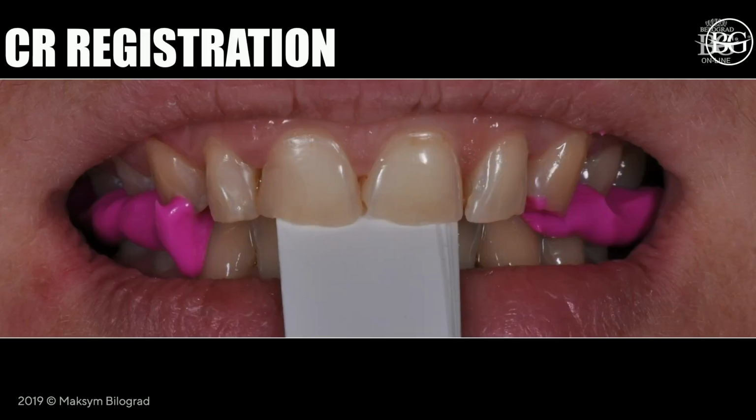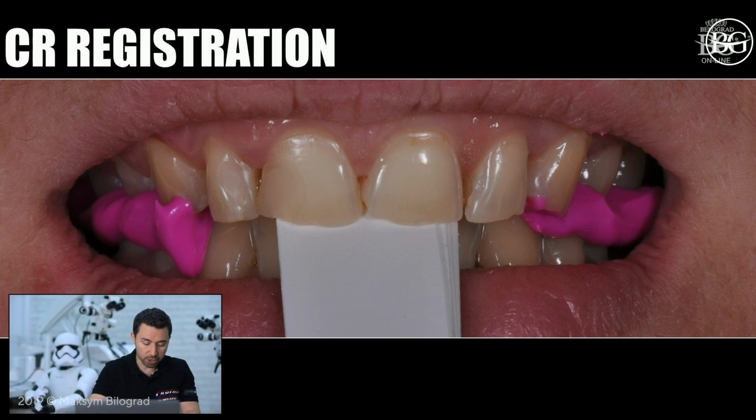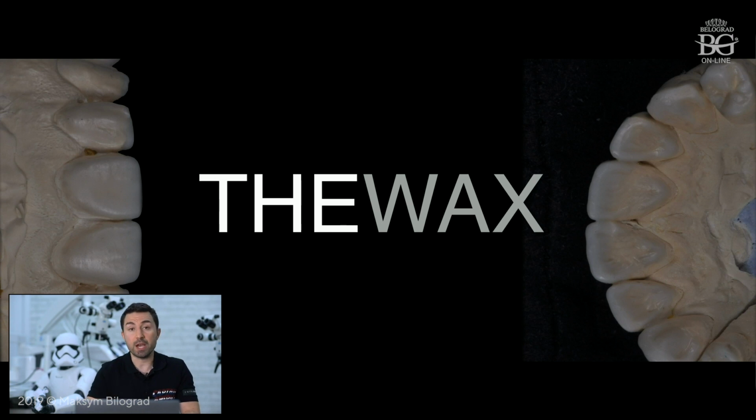During the first consultation we deprogrammed our patient, we registered CR, in this case using a leaf gauge, and then we transferred this information to the dental technician. Our dental technician took all the data that we gave him and made a wax-up in the articulator, in CR, driven by our aesthetic proportions for central incisors. I didn't mention that this case is pretty old. We made this case in 2013, so at that time we were working in analog, everything was done by hand.